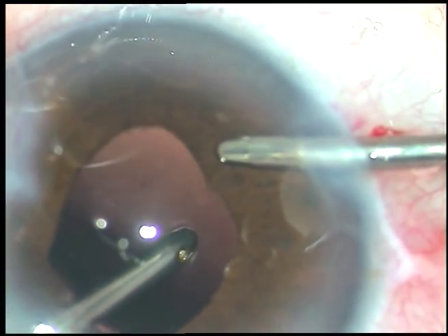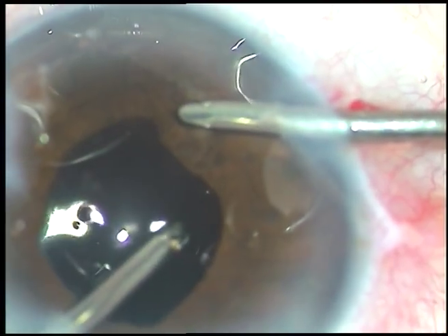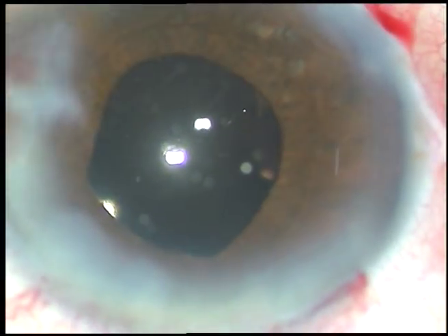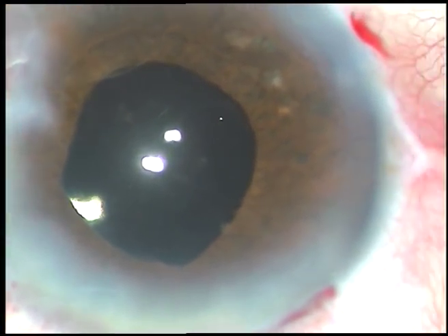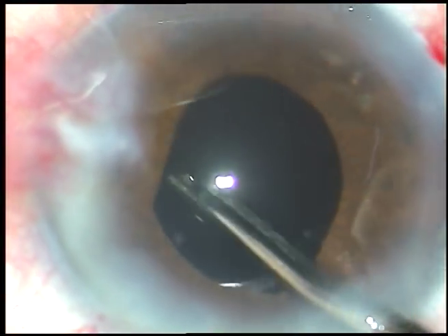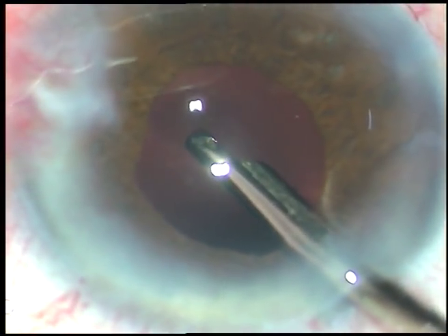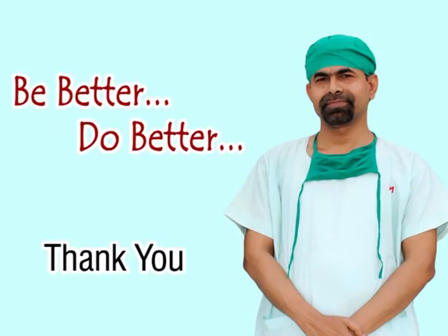Now the viscoelastic substance is nicely cleaned, the side ports are hydrated, and then a final lavage of the anterior chamber is done. After the final lavage the anterior chamber is formed and the case is concluded. Thank you very much for watching — hope this video will help you in developing your surgical skills.